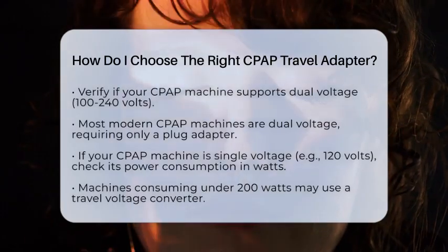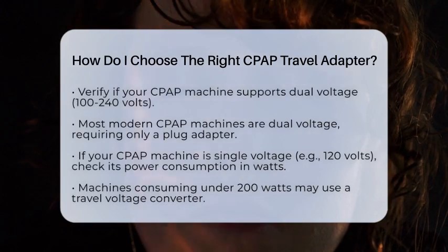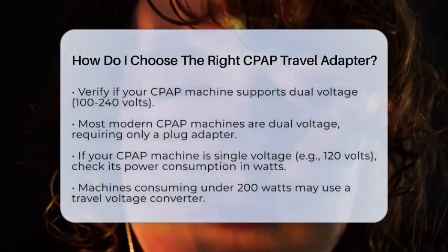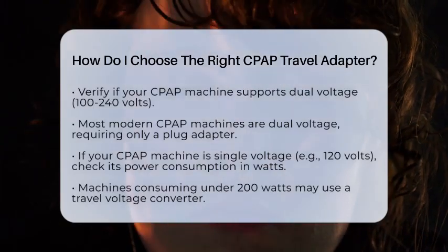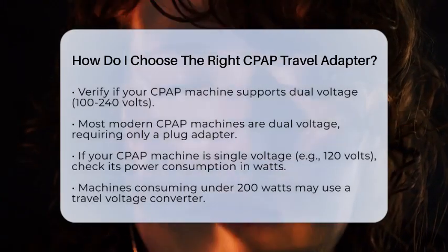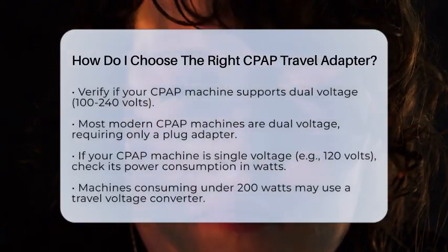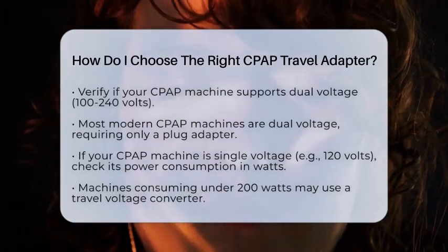First, check if your CPAP machine supports dual voltage. This is usually indicated on the power adapter, which should say it can handle input of 100 to 240 volts. Most modern CPAP machines are dual voltage, meaning they can work with different electrical inputs worldwide without any risk of damage. If your machine is dual voltage, you will only need a plug adapter to fit the local power outlet style.